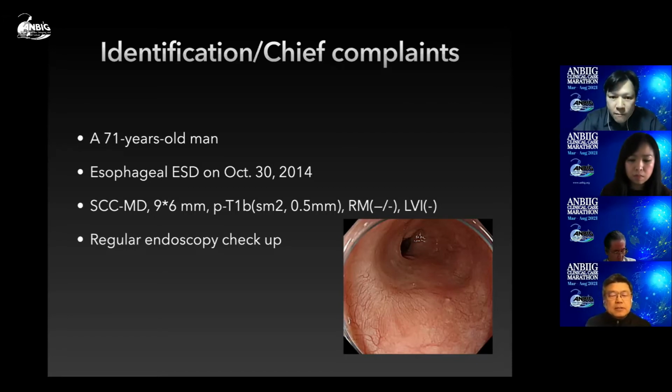So this time he received a regular endoscopic checkup. This picture is the previous ESD site.